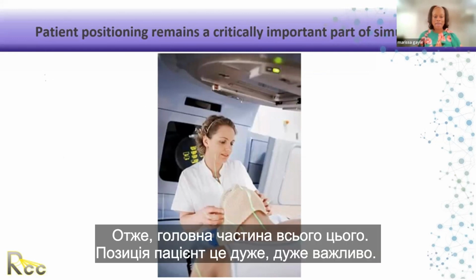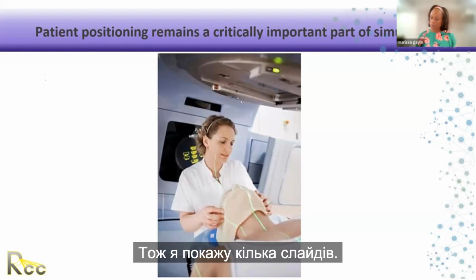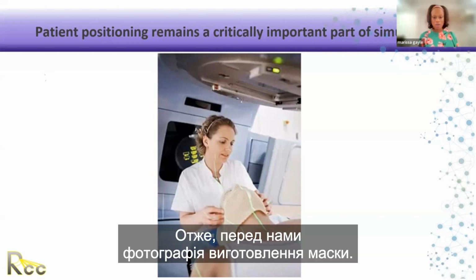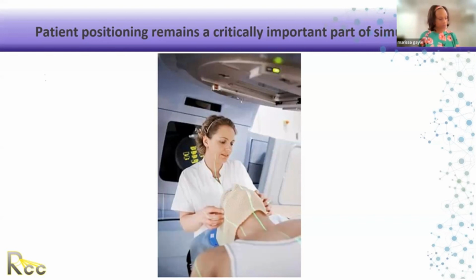So the main part of all this is patient positioning is super important. So I'm going to go over a couple of slides that are going to show you a couple of things that will help in the patient positioning process. Here we have a picture of a mask being made, but a couple of things I want to talk about before we get to that.